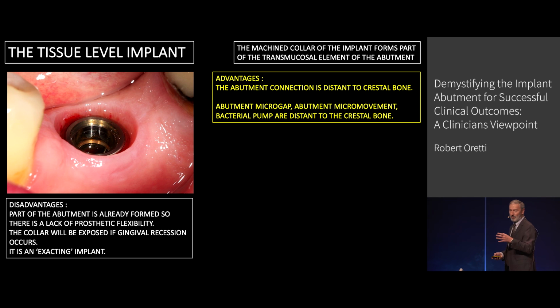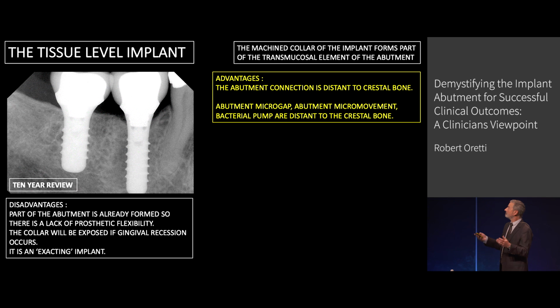Why? Because it's all above the crestal bone. So all our attachment, our micro gap, our micro movement of the abutment during occlusal forces is all above the crestal bone. And here's just a case. One implant, the distal implant, was placed level with the bone.